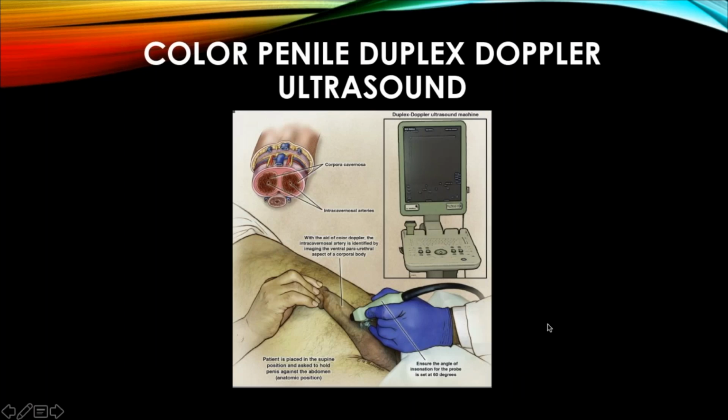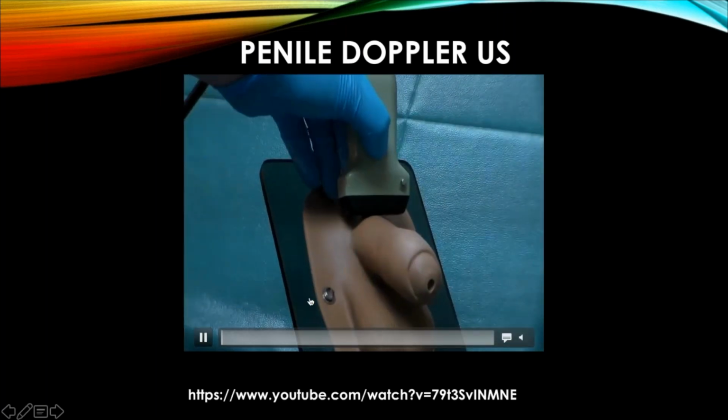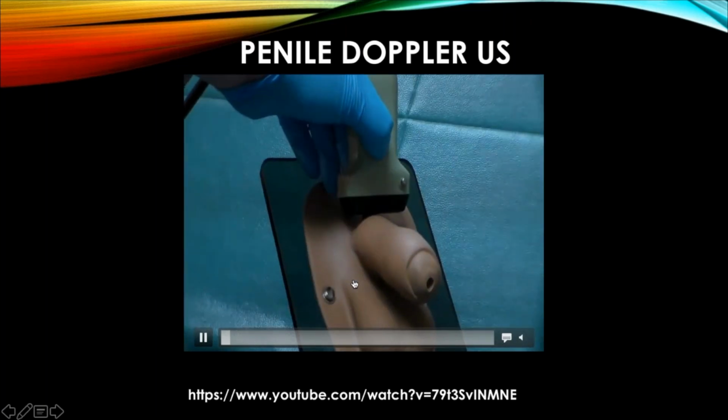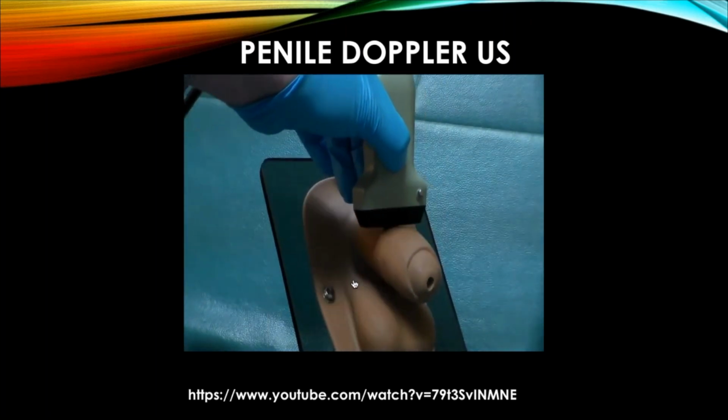Now, everybody has different protocols. I'm going to go over one of the protocols, but you will start imaging both dorsally and ventrally to identify the vessels, to look for, again, plaques, and then do all of our measurements that we'll talk about. So here's an ultrasound. We're going to look at painting and fanning techniques. Originally, you will usually start on the dorsum of the penis, because that's where the vast majority of Peyronie's plaques would be. Some of them are ventral as well.